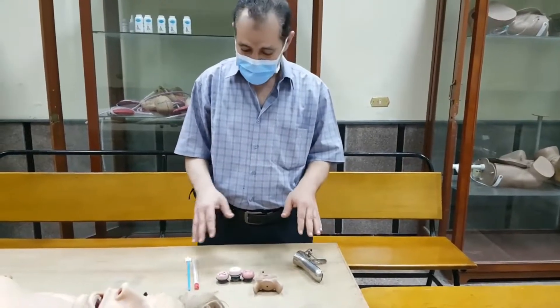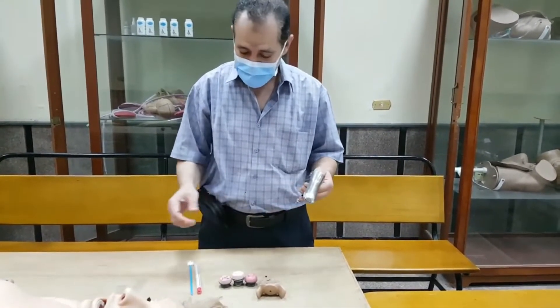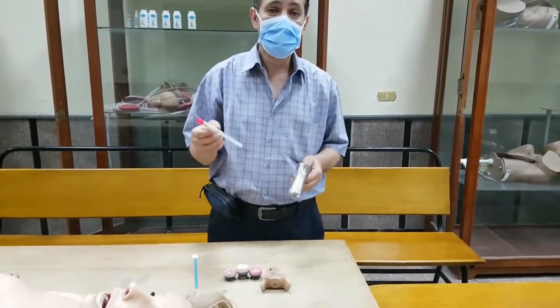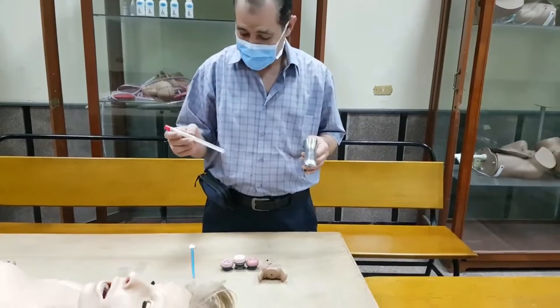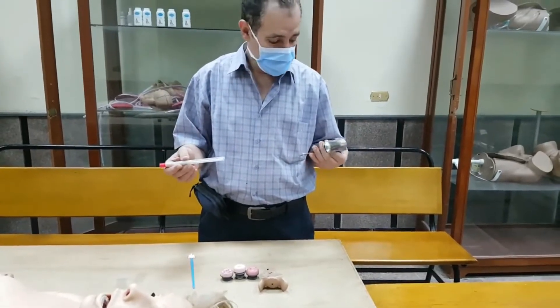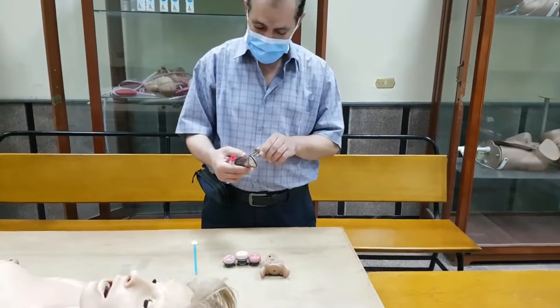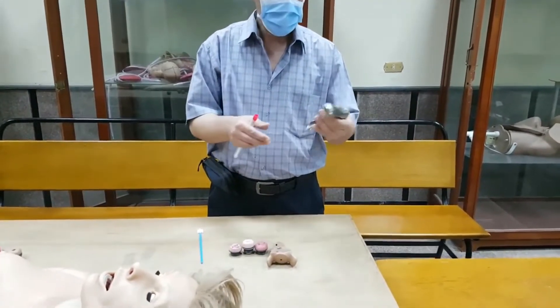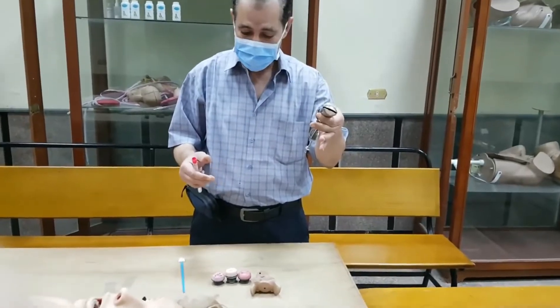Today I want to discuss with you how to do a swab for infection and how to do a cervical smear for cytology. What we want to have before the procedure: I want to have the Cusco speculum like that.